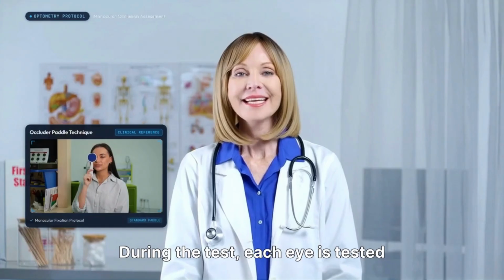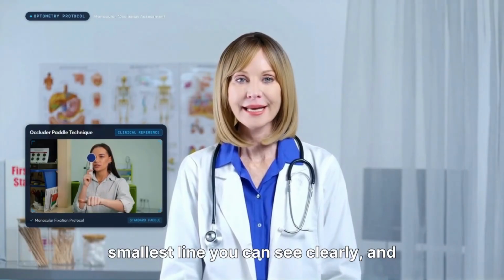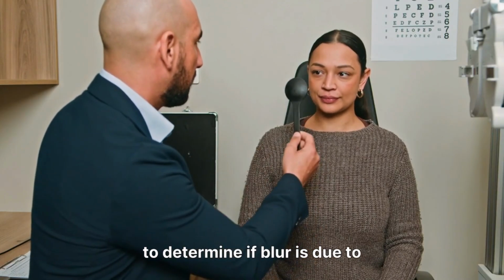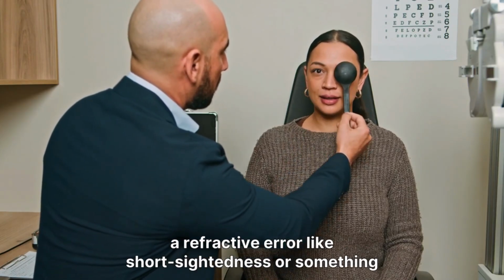During the test, each eye is tested separately. You cover one eye, read aloud the smallest line you can see clearly, and the optometrist records your score. A pinhole occluder may also be used to determine if blur is due to a refractive error, like short-sightedness, or something deeper.